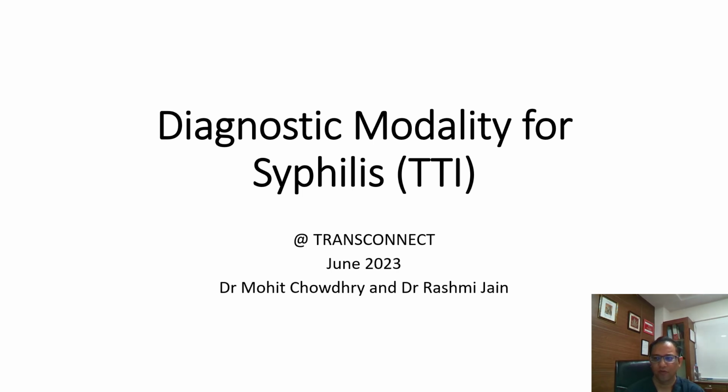Good morning, everyone. For this new episode of TransConnect on diagnostic modality for syphilis, that is the TTI, which we encounter so often in our testing. So everybody is doing the VDRL test or an RPR test or a CMIA for the same. And in transfusion medicine, it holds importance because it is one of the 5 mandatory tests that you have to do. This is TransConnect June 2023.